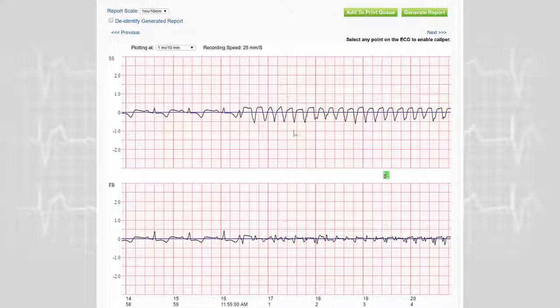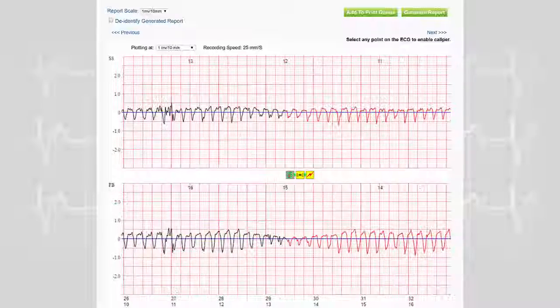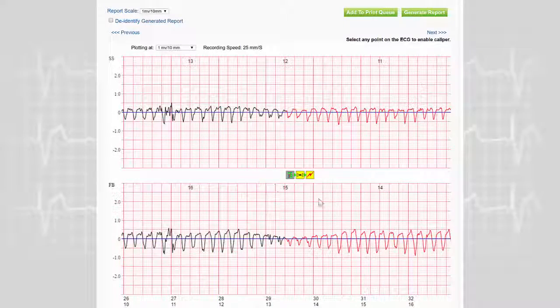The same kind of episode, a very fast ventricular arrhythmia. Initial detection of the arrhythmia, and then after 10 seconds, the start of the alarms.